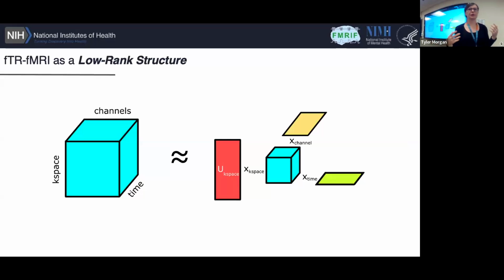The specific models that are used are basically up to whoever's designing a specific reconstruction algorithm here. But in the case that we just looked at, they were using what's called a low rank tensor structure, which is essentially just that you can do something like PCA, but rather than having only 2 dimensions like you do in typical PCA, you now have many dimensions. This is a class of mathematical problems called tensor decomposition. And they are awesome.